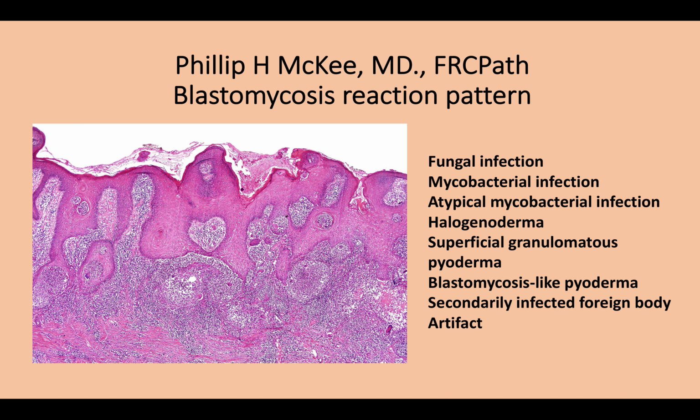a pseudoepitheliomatous pattern. And then within the dermis, one sees numerous abscesses in association with giant cells and granulomata. Sometimes these inflammatory changes may be seen within the epidermis itself. And when you look at this type of histology, there are a variety of diseases which should come to your mind. Most cases, maybe 95% of cases, will be of an infectious nature.